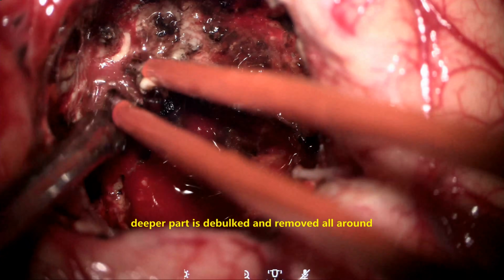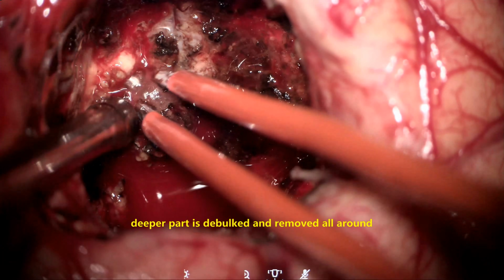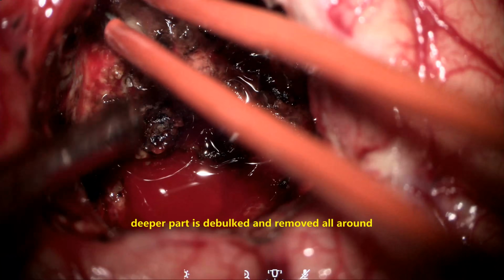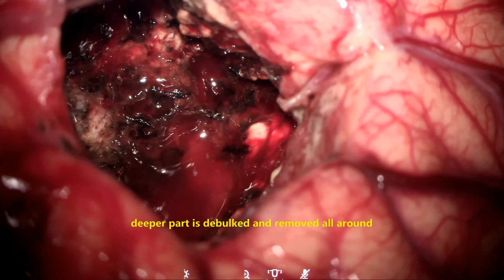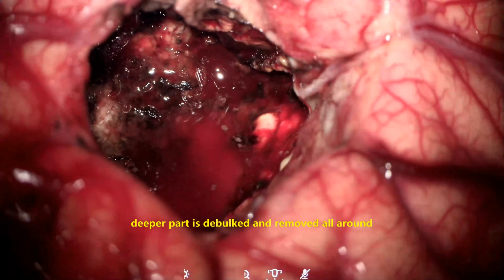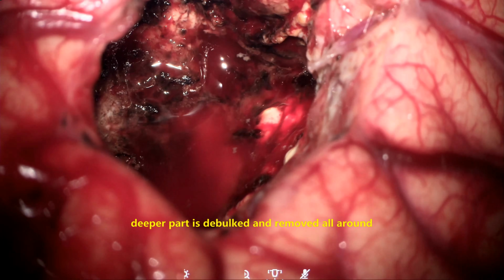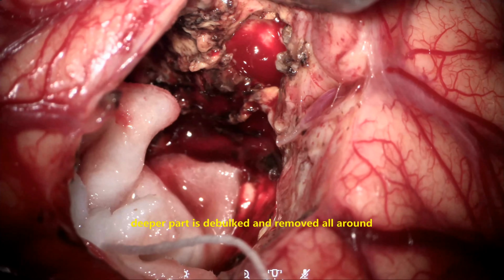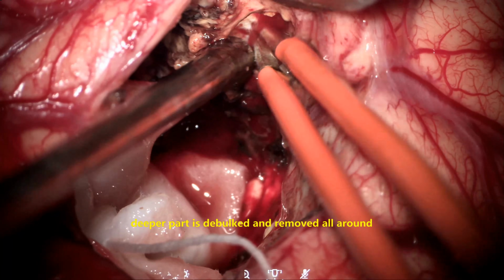You see the blood vessels, which are very high vascularity, and they are all in the tumor bed. They need to be understood and coagulated. Absolute hemostasis is achieved and all the areas are debulked: anterior, posterior, medial, lateral, and inferior.